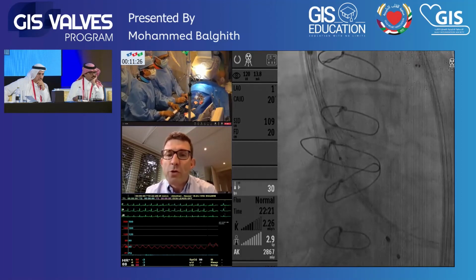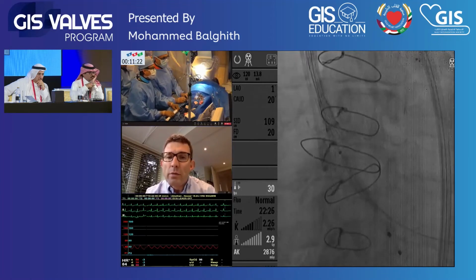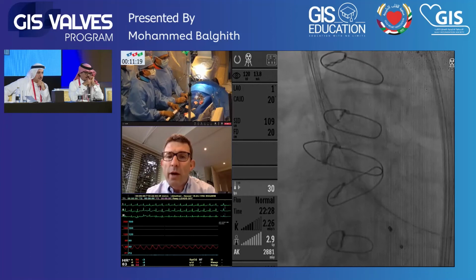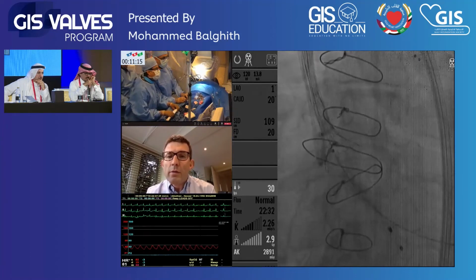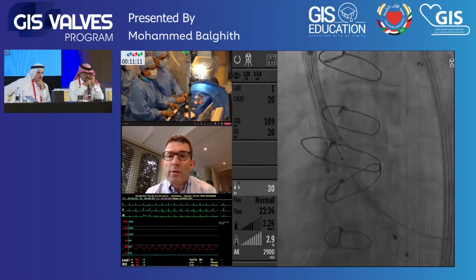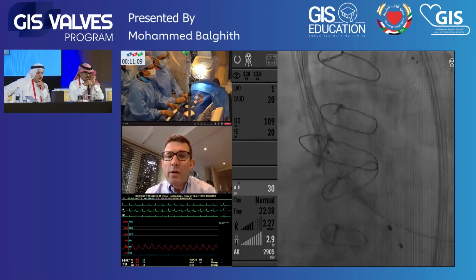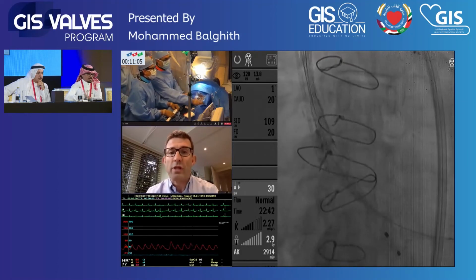So see if you can push the device in slowly now. Little bit deeper. Same movement you do with Medtronic. Nothing extra. Almost the same. Yes, that looks good. And the pressure improved immediately by itself. Pressure a little bit down now, but okay, we'll just continue now to unsheath the valve again.